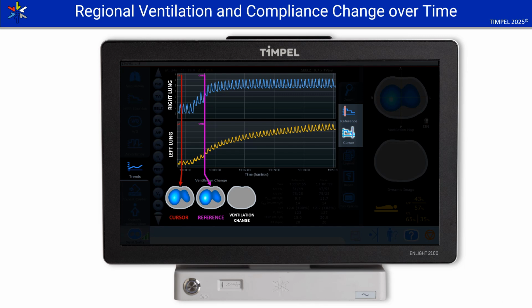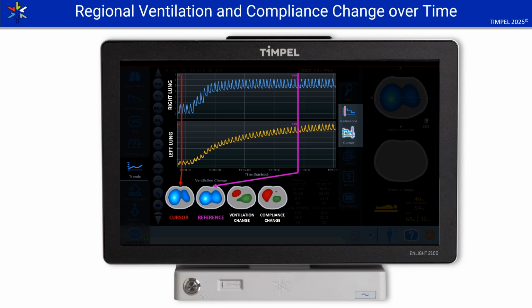With the trend tool, we can analyze and compare two different time points up to 48 hours. What we see here is the effect of increased PEEP, leading to regional lung mechanics changes from a right lung and left lung perspective. The trend is visible on the right and left plethysmograms. On the ventilation change map, green indicates an increase in ventilation, while red indicates a decrease. Similarly, we can generate a map showing regional compliance changes, as illustrated here.